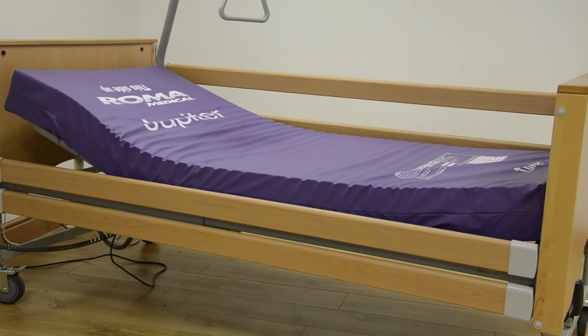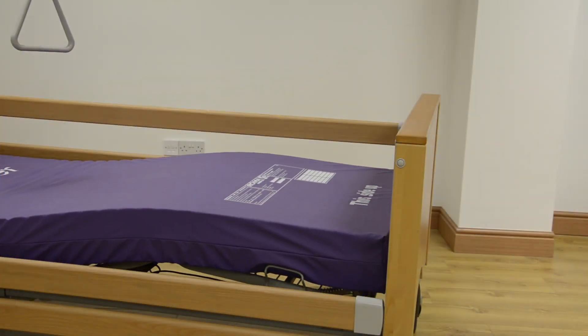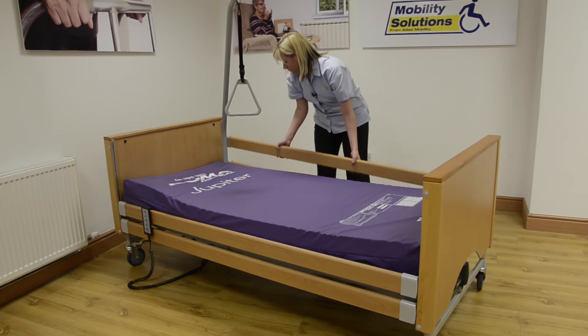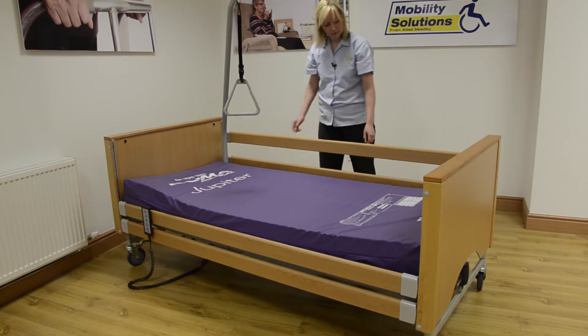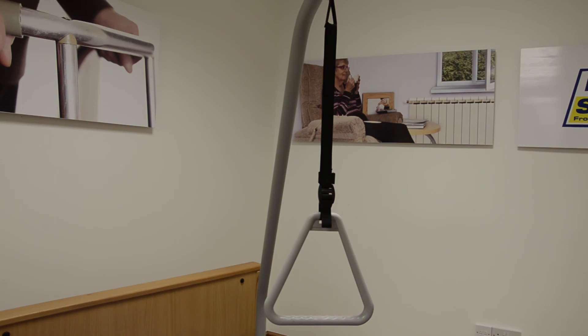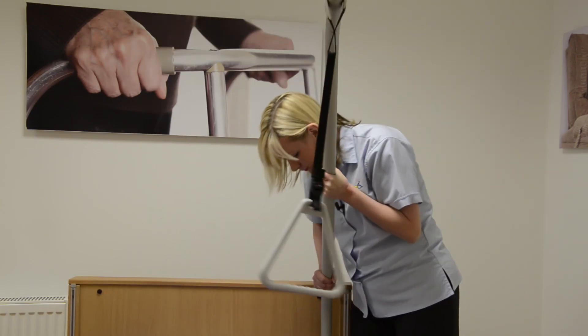This allows you to either sit upright with your legs flat or lie back with your legs elevated. Safety is a huge plus with the Siesta. It has two easy to operate drop-down rails, making it useful for people at risk of falling out of bed. There's also a handy patient helper with adjustable trapeze handle, which can be used to help you sit up in bed more easily.